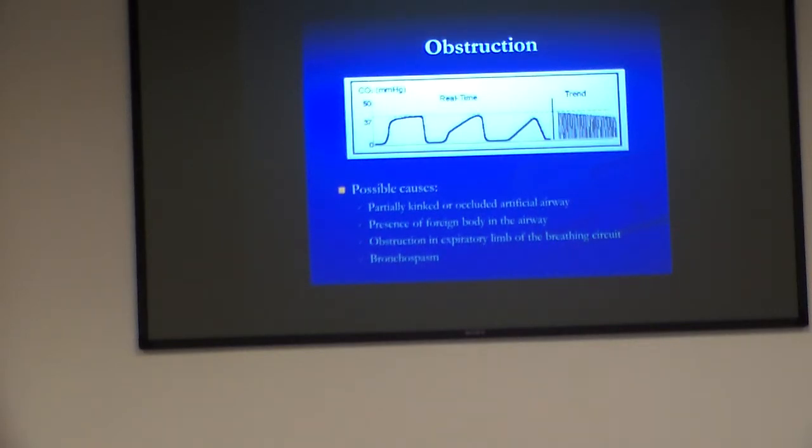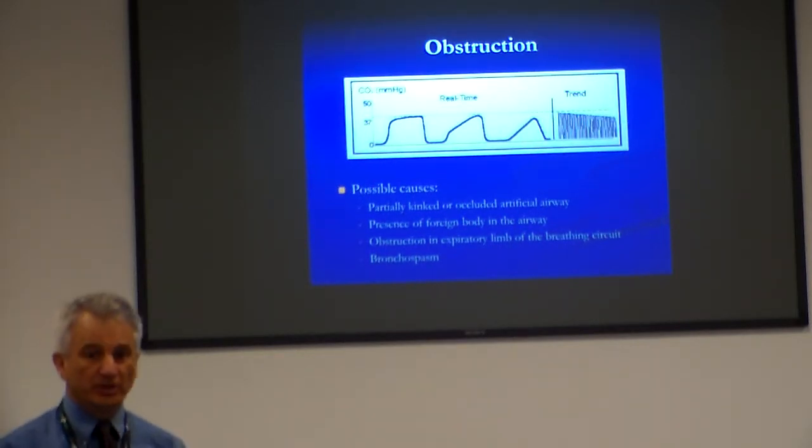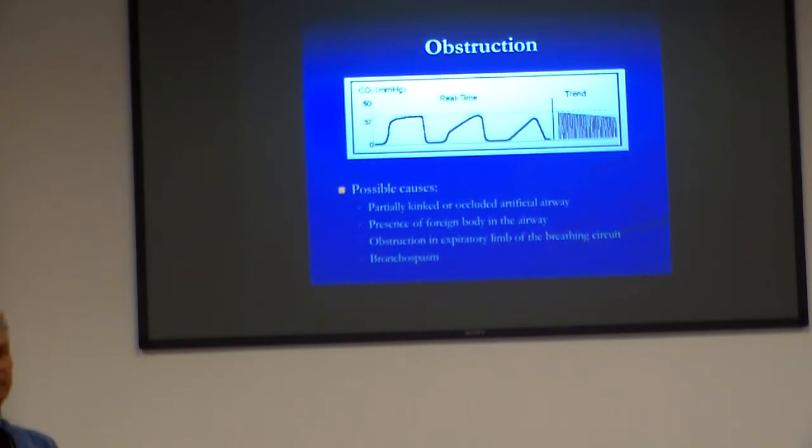Okay. I love it. The veteran medics are the ones who ask the best questions, you and Jetty and others. That's going to be in the second half. We're going to compare what you expect to see in the COPD patient, that's an obstructive patient, versus the young asthmatic with severe bronchospasm. Again, there are different patterns and different presentations.